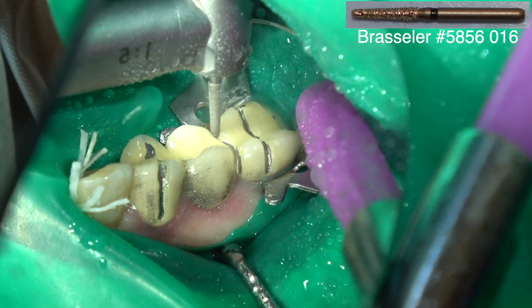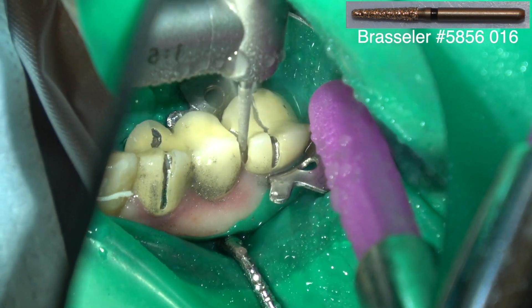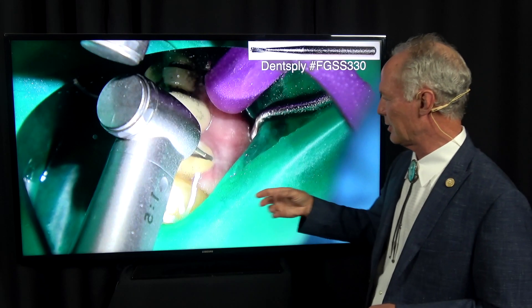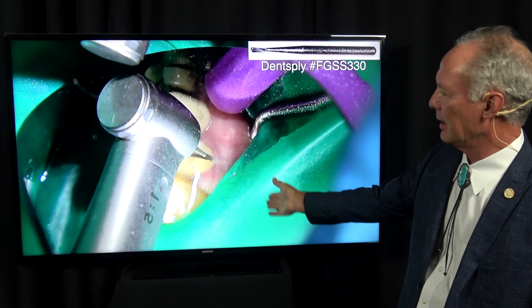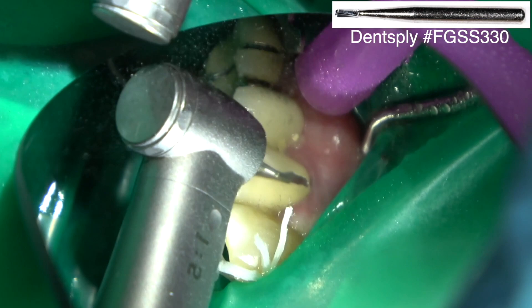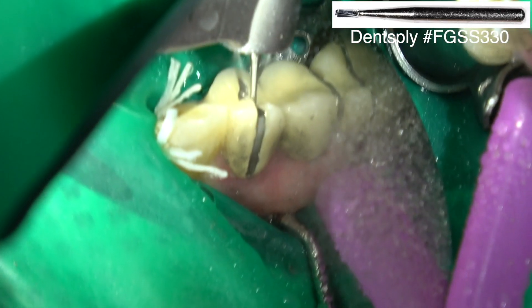I'm just cutting through the porcelain. I like to use an electric handpiece for this because there's so much torque on it. If you're using a small head air-driven handpiece, it's putting lots of torque and you may burn out or ruin a turbine. So I like to use an electric handpiece. This is a 330 carbide bur to cut through the metal — lots of water — and you can see how all the pieces are being caught by the rubber dam and the water spray, so they're not floating around in the patient's mouth.